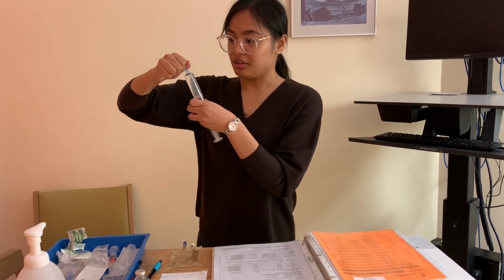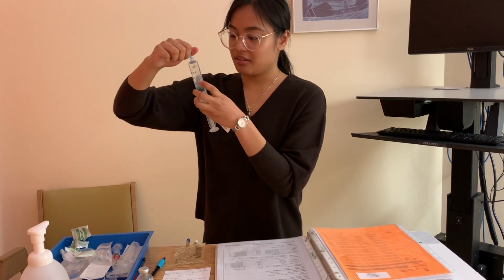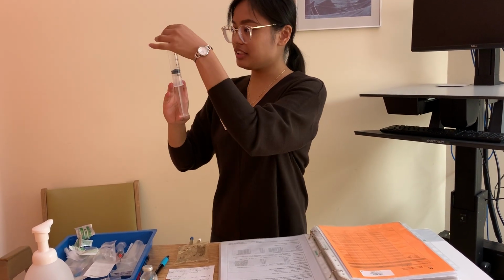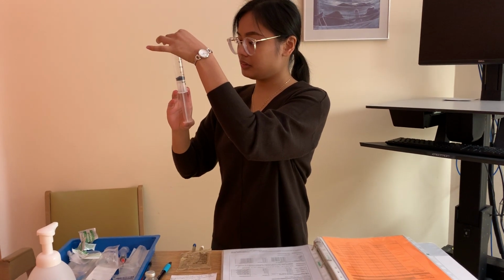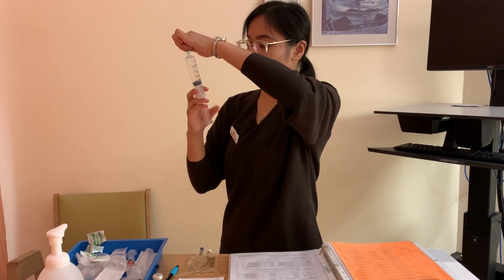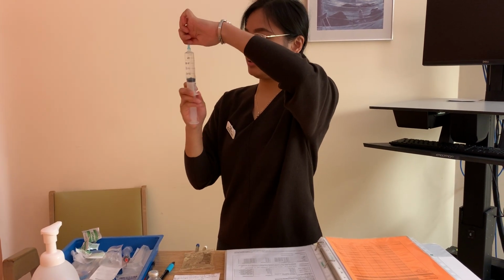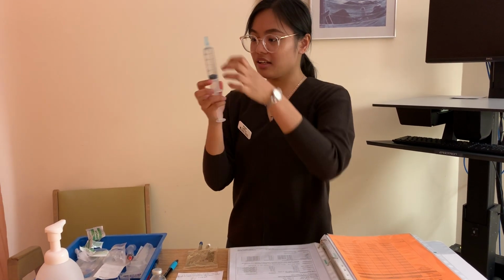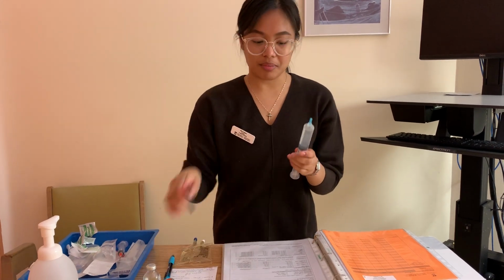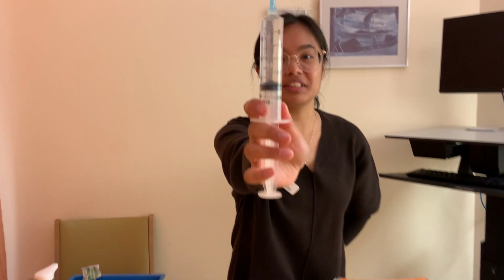I'm just going to loosen the cap a bit so I can recalibrate a little bit. I'm not going to touch it. Okay, now it's 25 mLs. So that's 25 mLs. I'm ensuring a sterile technique. I'm going to get rid of the air bubbles. Okay, so that's 25 mLs total that I have.